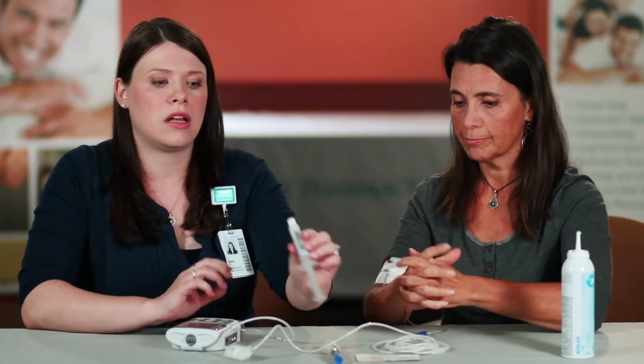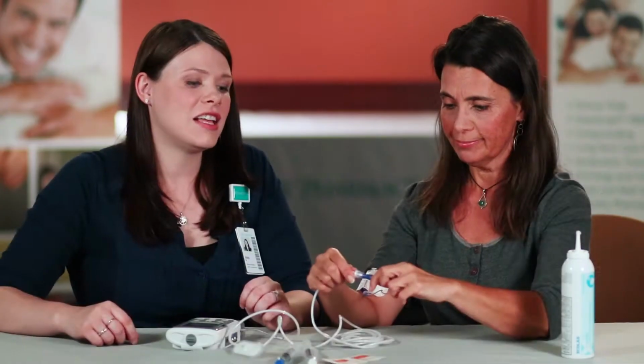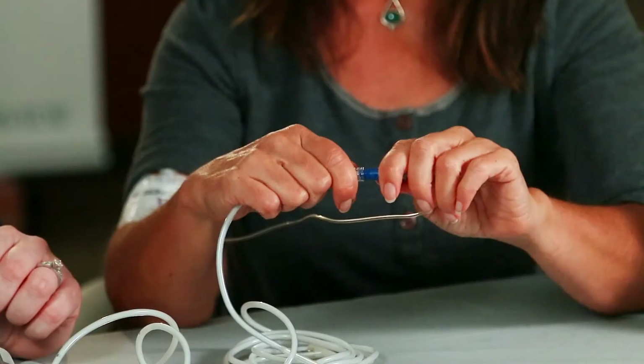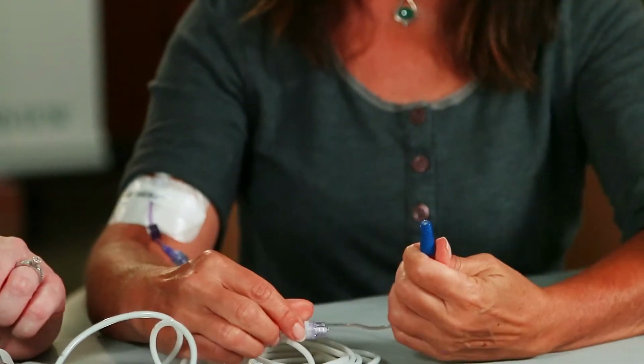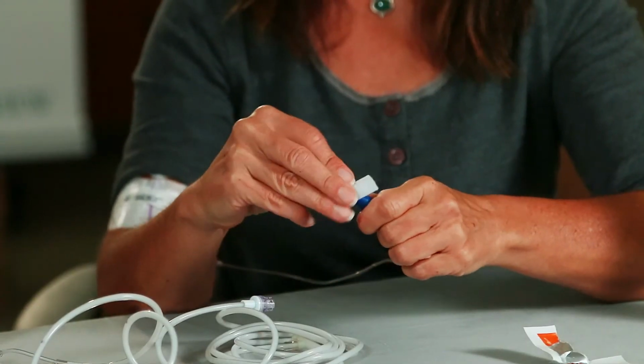To disconnect from your PICC line, you will need the foam hand sanitizer, a saline flush, a heparin flush if indicated, and two alcohol prep pads. So now you can disconnect your TPN from your needleless connector. You're going to take a fresh alcohol prep pad and scrub your needleless connector for 15 seconds using good friction and scrubbing motion.